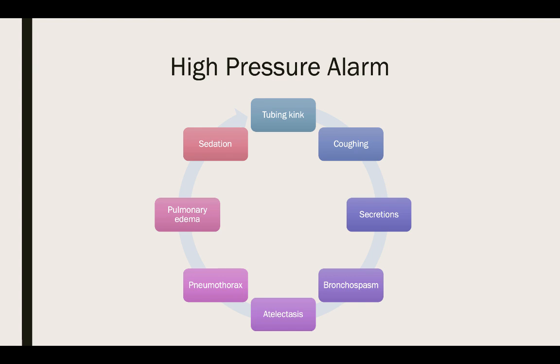Sedation-wise, pay attention to this one and pay attention to your vital signs. If you've got a sedated patient, if you've got a paralyzed patient, once the sedation starts wearing off, they're still paralyzed, but the sedation is wearing off. This is one of those signs that you need to resedate your patient.